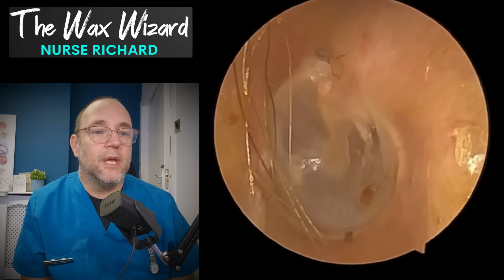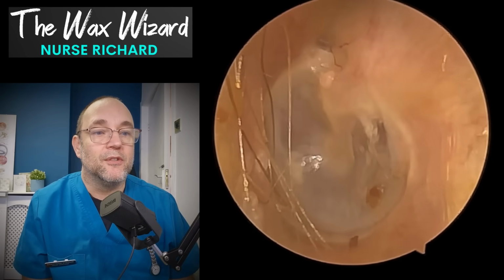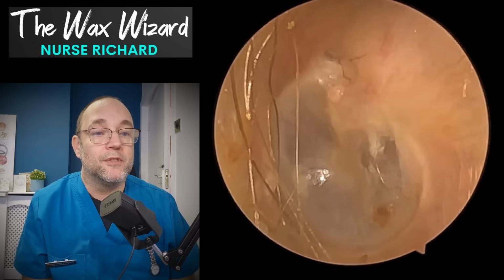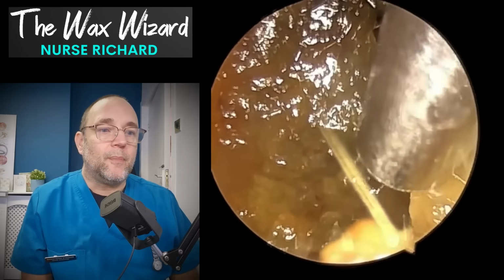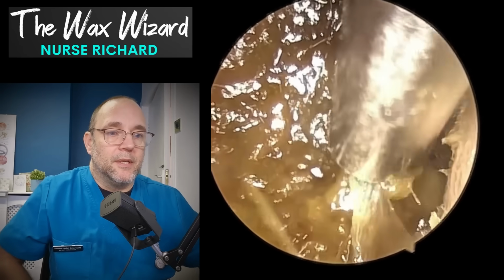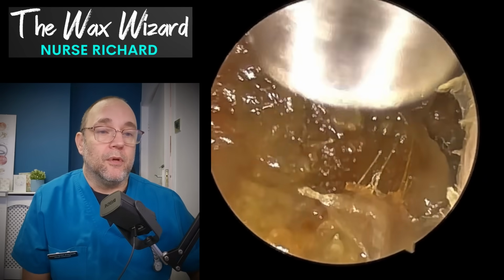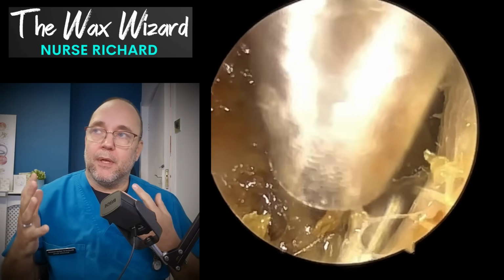Now what I'm going to do in a second, I'm going to ask the patient to stop breathing just for a short time, and you'll see it stops. Can you see there? It stopped. Then I'm going to ask him to start breathing again, and it starts again. And some of you will know what that is, it's called a patulous eustachian tube. For those of you who don't know, what is that? Let me explain it.